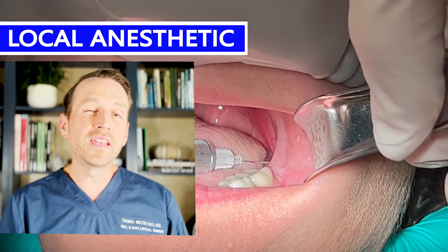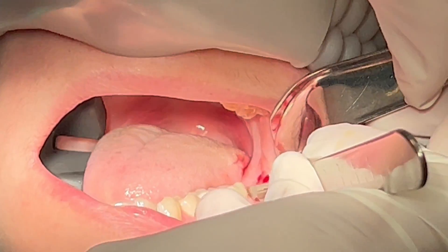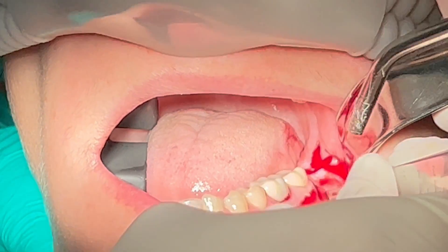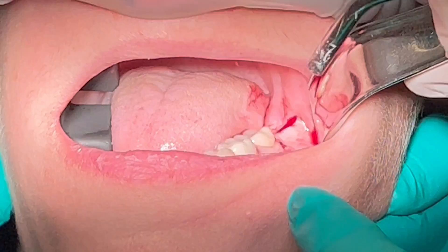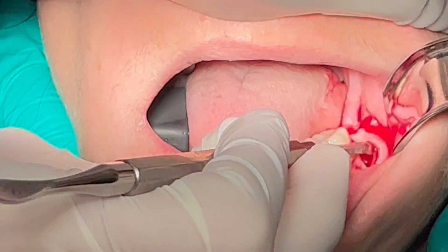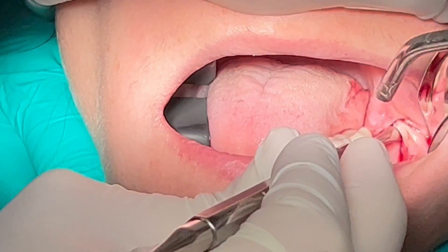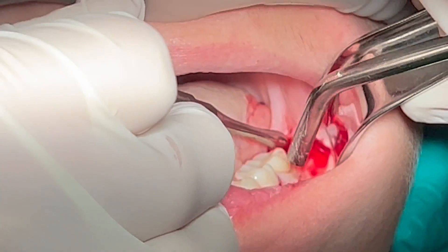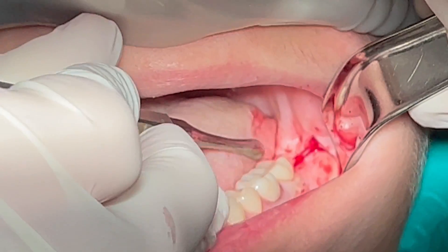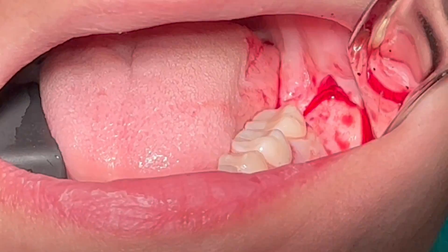I administer local anesthesia and then make an incision similar to what I would make for a third molar surgery. I elevate a full-thickness mucoperiosteal flap and expose the underlying bone.